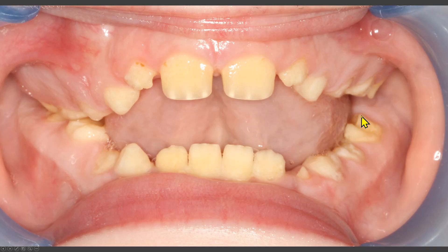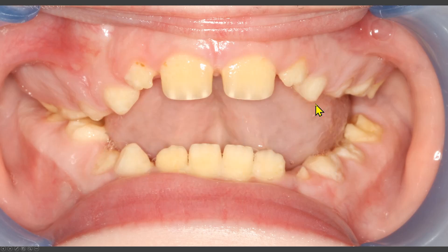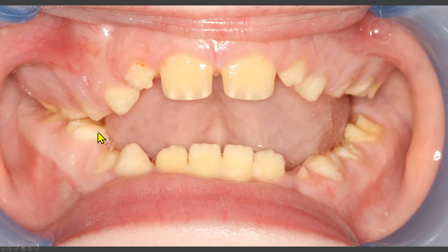We see the pointed cusps of the molars. This finding is known as picket fence — multiple pointed cusps. The pointed cusps of this molar are broken off, and now the occlusal surface is flat from attrition.